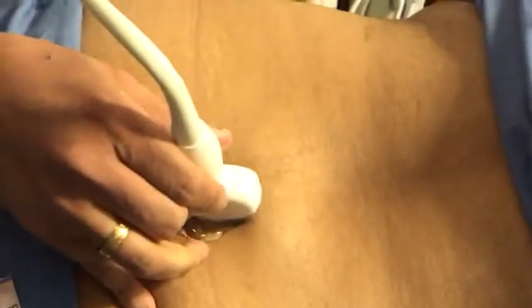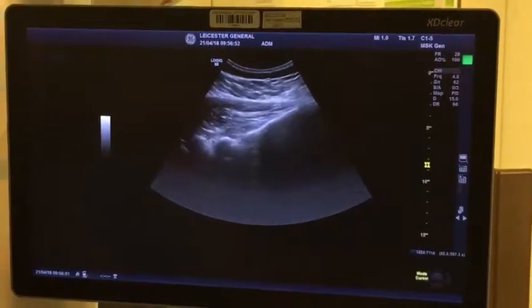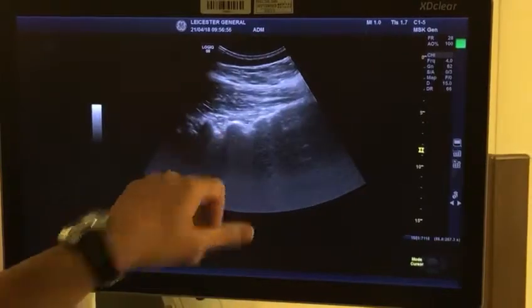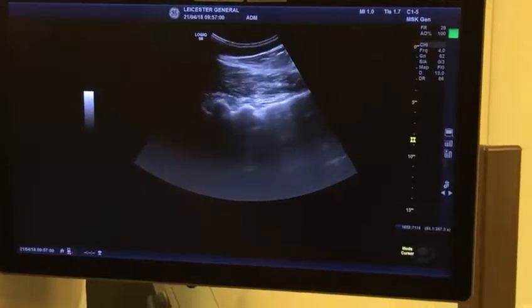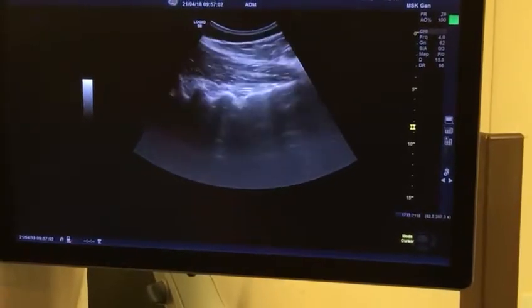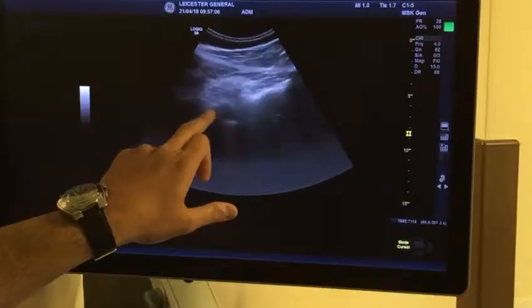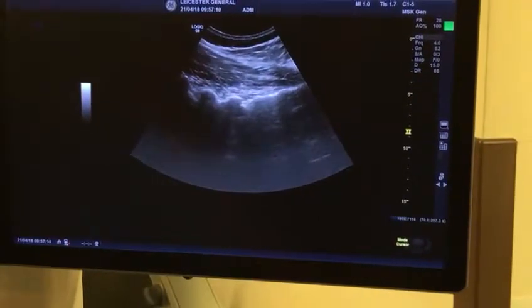So left is proximal, right is distal. When you see a straight line, that's your sacrum. You all agree with that? Yeah. And then you see the line breaking, L5 S1, L4 L5. It keeps climbing up. So now we're losing the gel. Sacrum, L5 S1, L4 L5, L3 L4. Okay, that's the way to count the level.